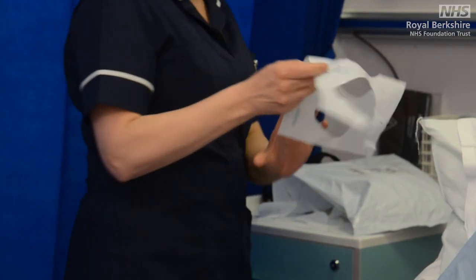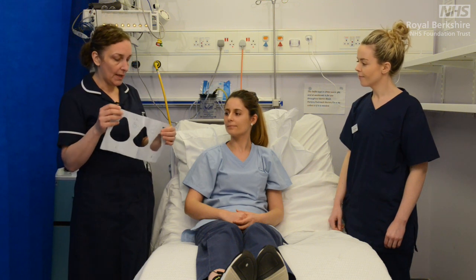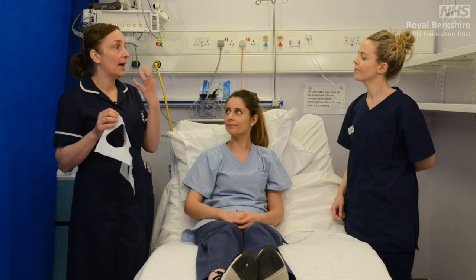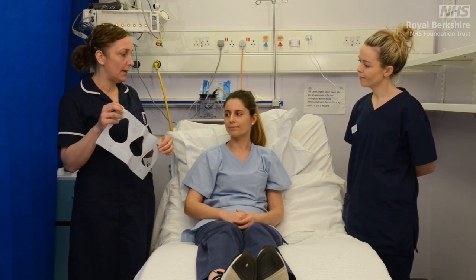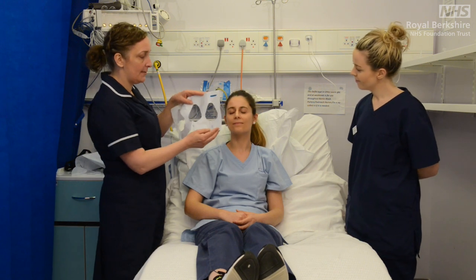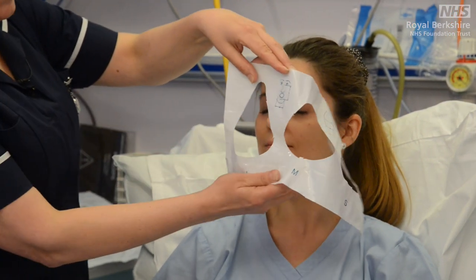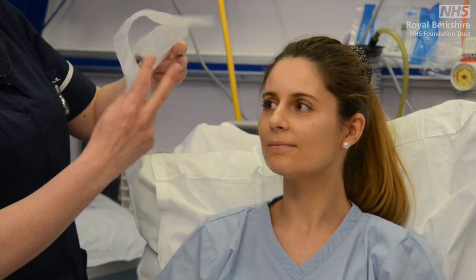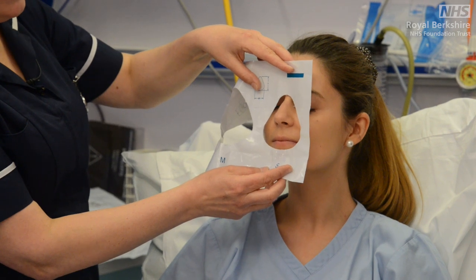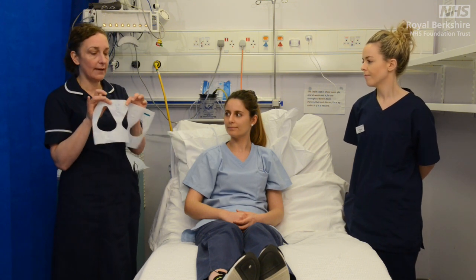You will now end up with something that looks like this. The landmarks that we're looking for are the bridge of the patient's nose and the cleft of the patient's chin. The majority of patients we'll be starting on non-invasive ventilation will actually be mouth breathing, and therefore will have slightly larger landmarks to look for. We literally present this up to the patient's face, looking for our landmarks. With the large it goes beyond our landmark; the medium looks slightly too big; and the small would be the one to go with. If you forget the landmarks, there is a guide on the actual packaging itself.